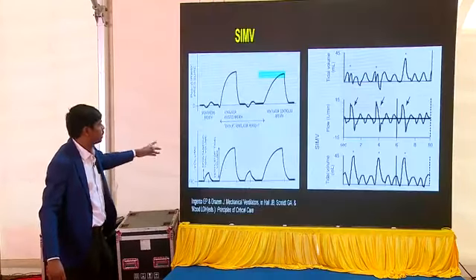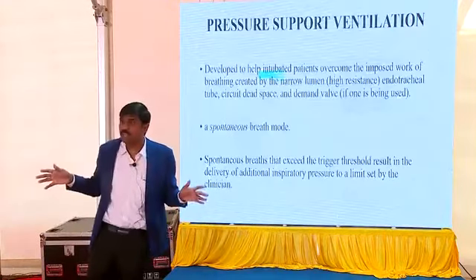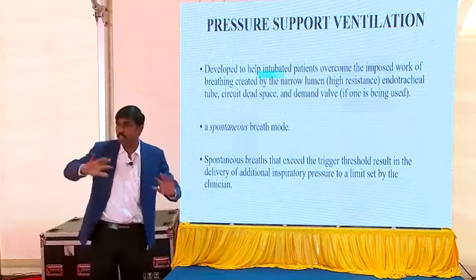Okay, the next one is pressure support ventilation. Has anybody used this, PSV? Good, at least nobody has used it, because even we don't use it as a primary mode.